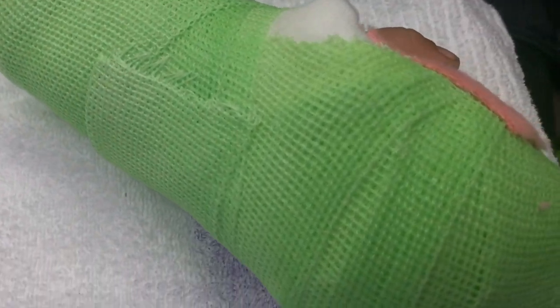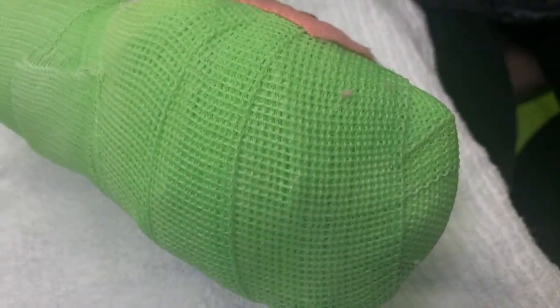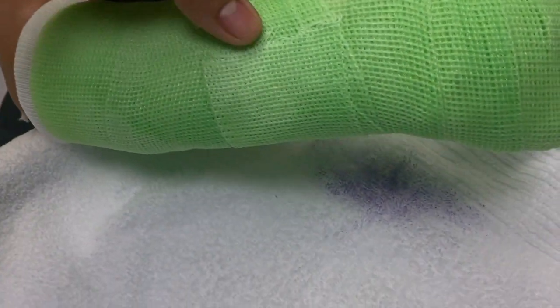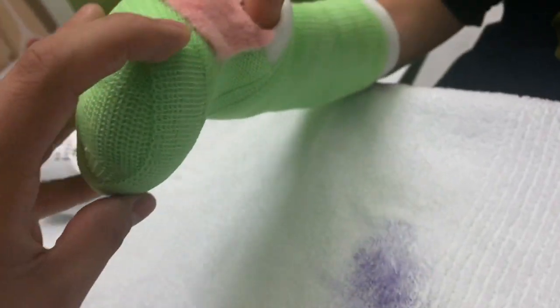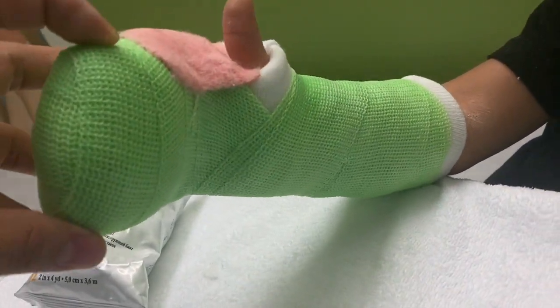I also applied this short arm end cast on a patient who had a nail bed injury. Injuries like this usually happen when a patient gets their finger slammed by a door or a car door, so just be careful when you're shutting doors, especially if you have toddlers around you. This cast will be on for about two to three weeks.